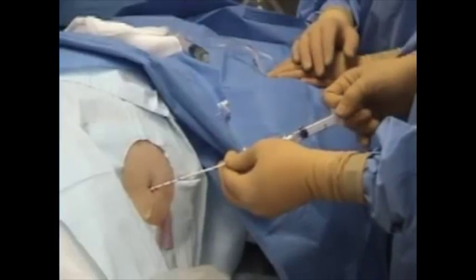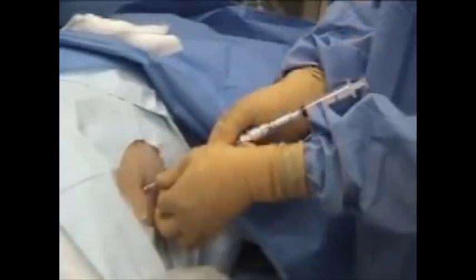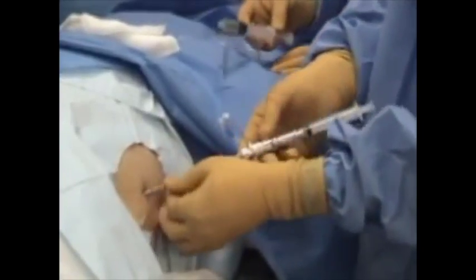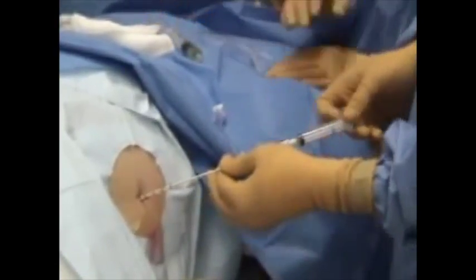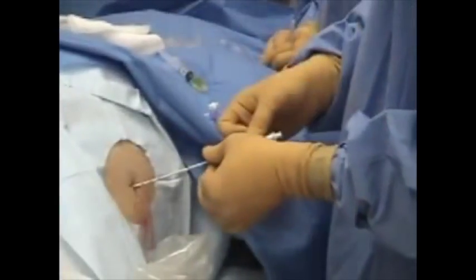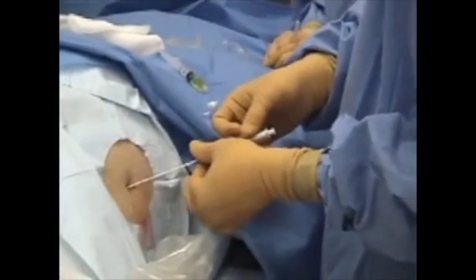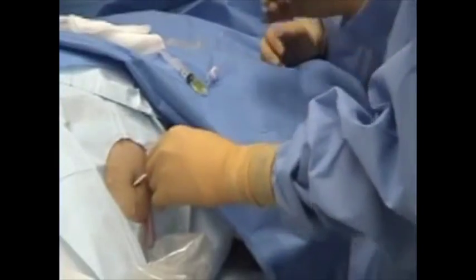Intermittently pull back on the plunger as you continue to advance the needle through the subcutaneous tissue. You may feel a sudden loss of resistance when the needle pierces the peritoneum. Immediately stop advancement once the ascitic fluid begins to fill the syringe. Next, guide the plastic catheter over the needle and into the peritoneal cavity, and then remove the needle.